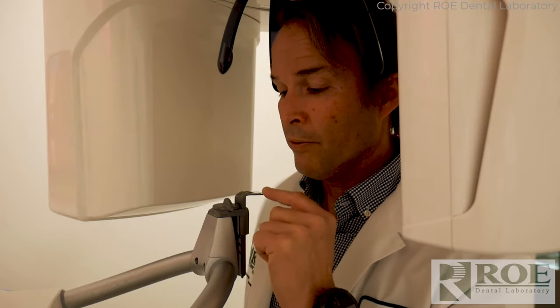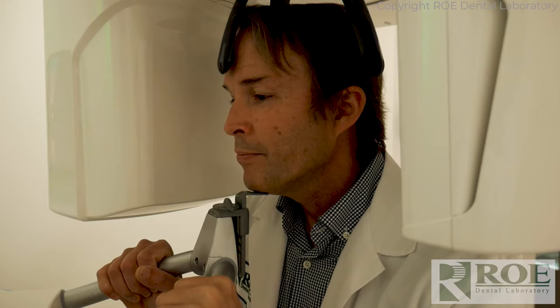Have your patient enter the machine and put their chin on the chin rest. Different machines have different types of chin rests, but just have them place their chin on it, bite together, and make sure you visually confirm that they are biting in their habitual denture bite — they're coming together — then take the CT.